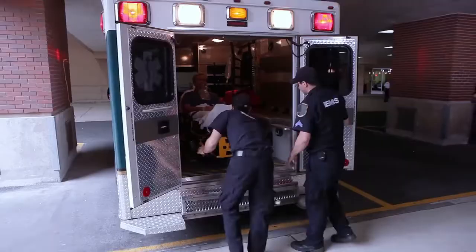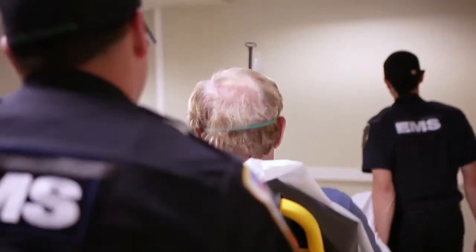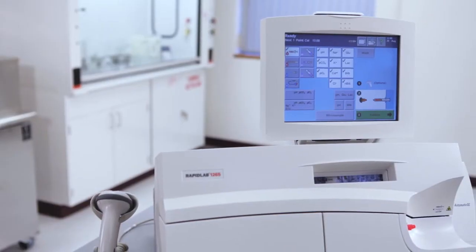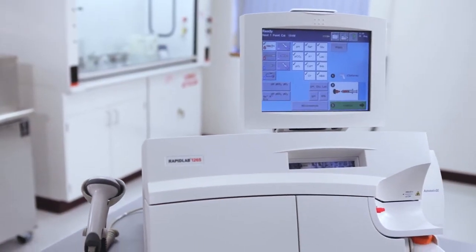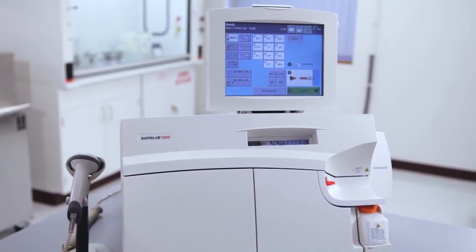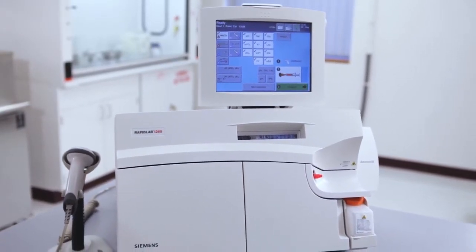When seconds count to make critical care decisions, clinicians need accurate patient test results fast. The RapidLab 1200 blood gas system, a high-throughput critical care analyzer that delivers test results in just 60 seconds.